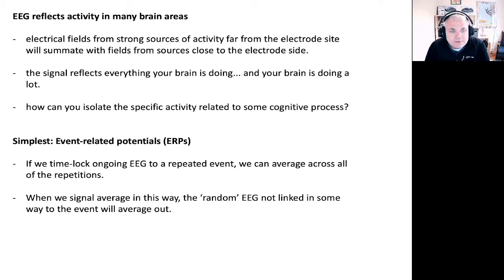So that's why we call these event-related potentials, because they're the potentials, the voltage potential in the brain that's only associated to the time locking event. They're related to the event. And in the next short talk here, we're going to talk at considerably more length about the use of ERPs in clinical research and in clinical applications and also in research applications.